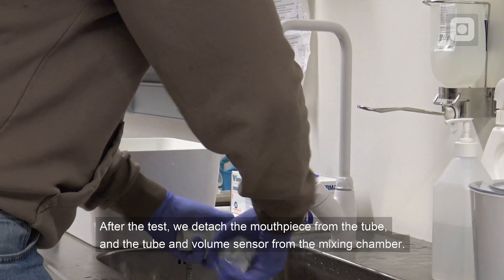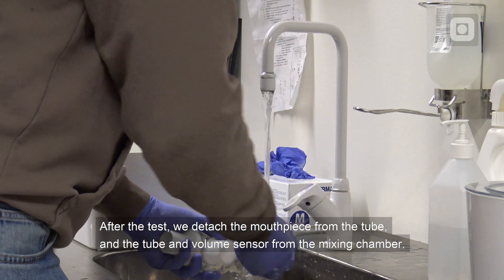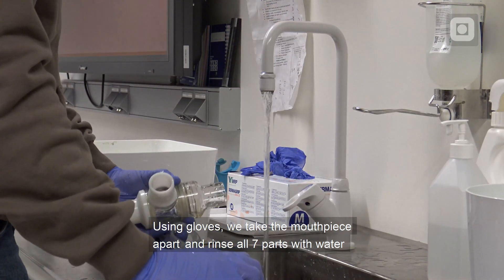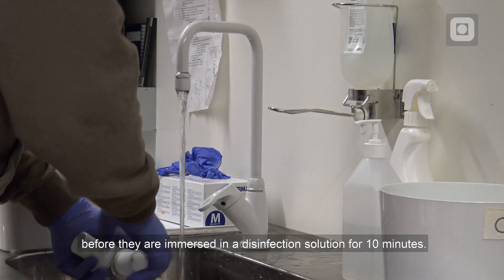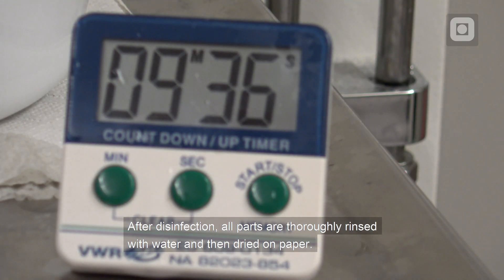After the test, we detach the mouthpiece from the tube and the tube and volume sensor from the mixing chamber. Using gloves, we take the mouthpiece apart and rinse all 7 parts with water before they are immersed in a disinfection solution for 10 minutes. After disinfection, all parts are thoroughly rinsed with water and then dried on paper.